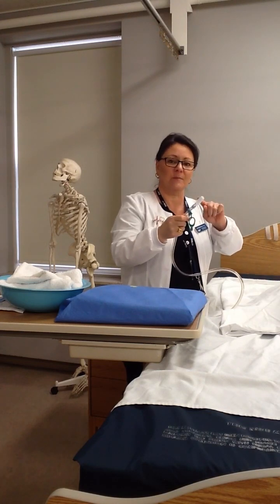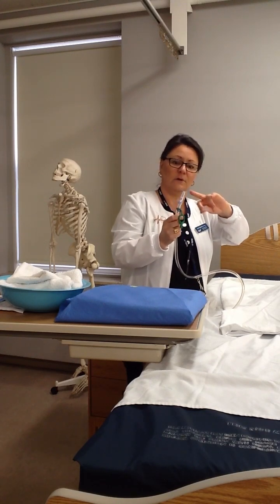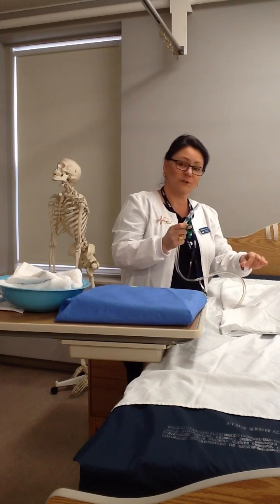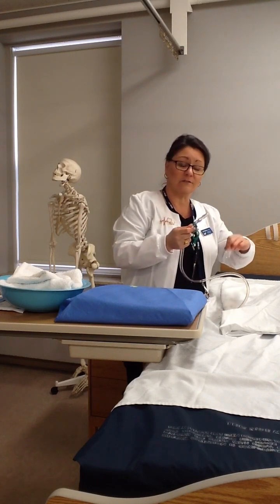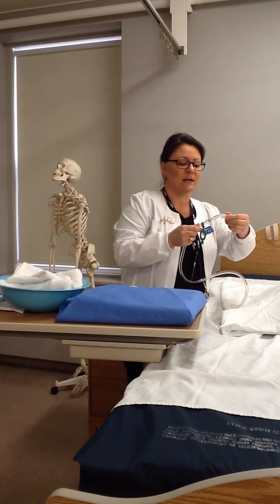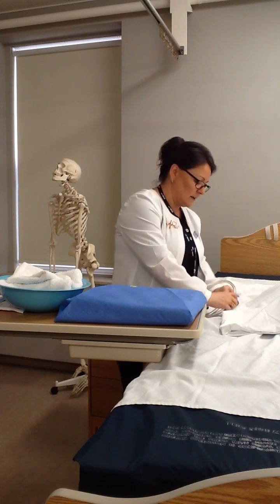You can see it has a cap on the end. Underneath that cap is sterile. Only sterile can touch that sterile cap. And so when we have our catheter inserted, there's a lumen at the end that is sterile as well that the urine flows out of. That's going to attach there. So we're very protective of those two ends. I'm going to put that cover back on. I'm going to set that right here. Okay.